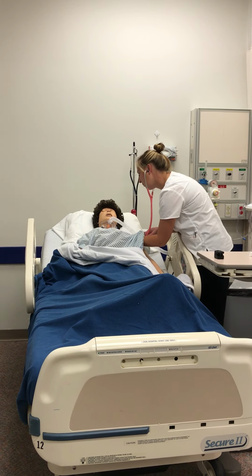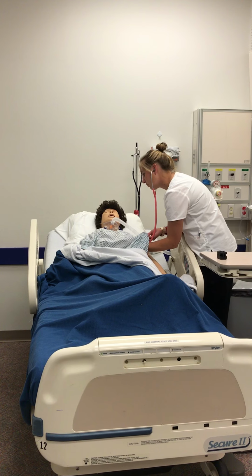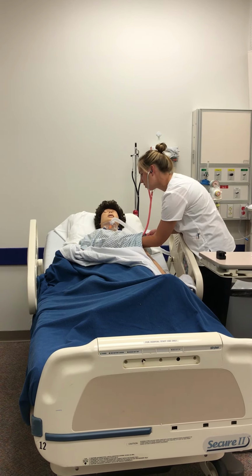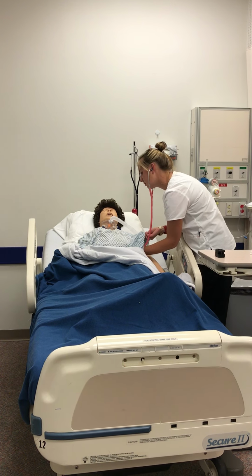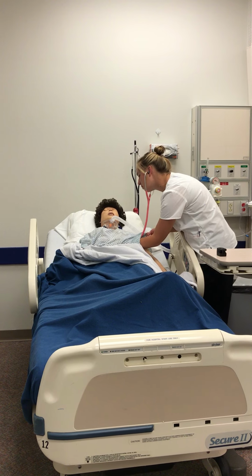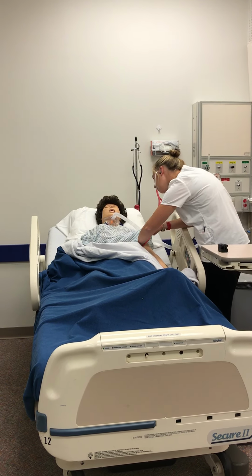Good. Breathe. Good. Breathe. Breathe. Last two. Good. Listen to the lower lungs on the side.